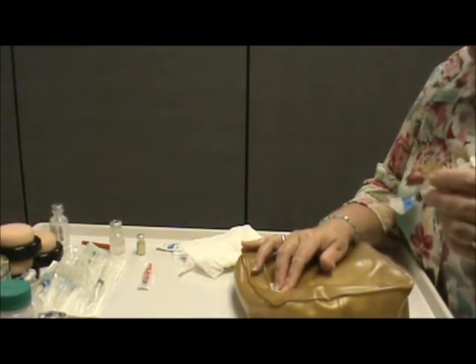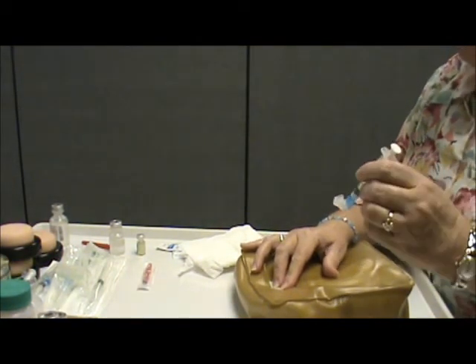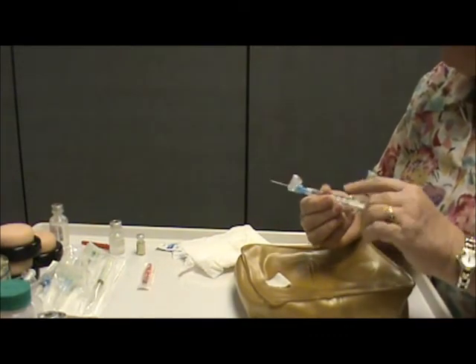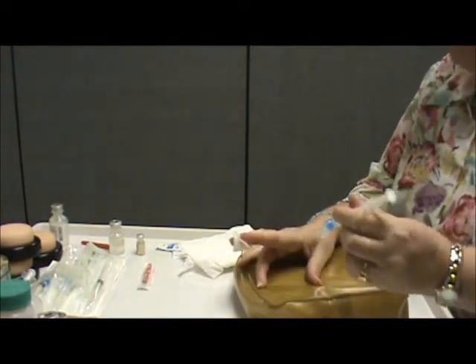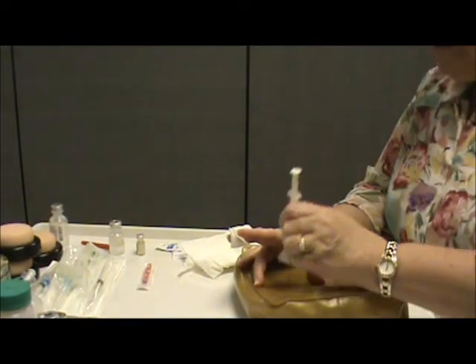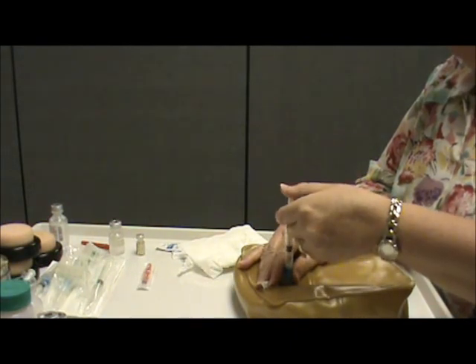Alright. I always suggest that in order to help you remember the steps, you say, you're doing a darting action, inject, stabilize, aspirate, inject.